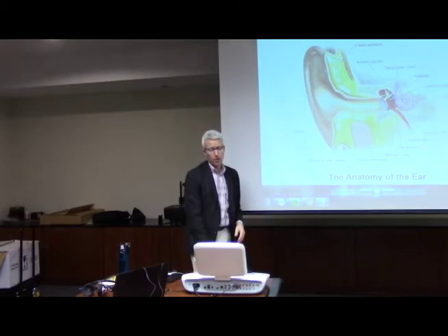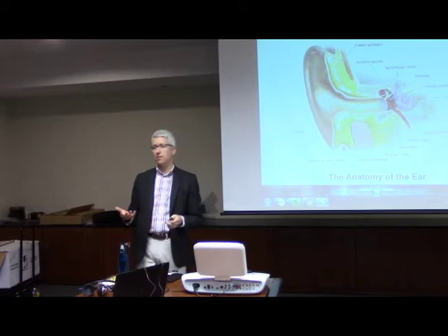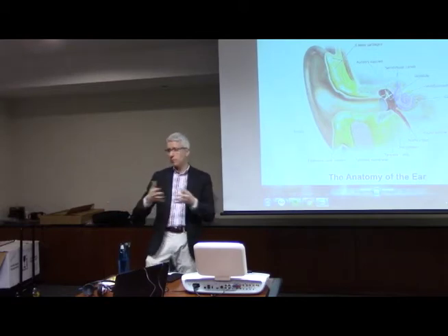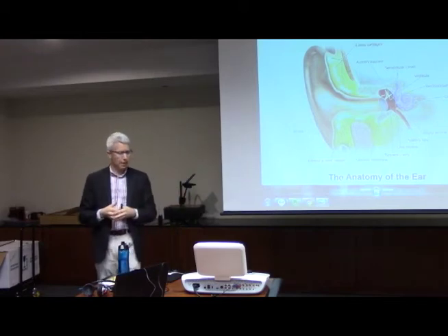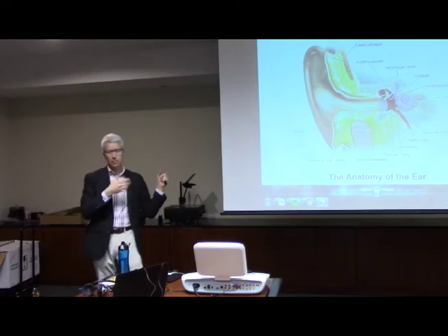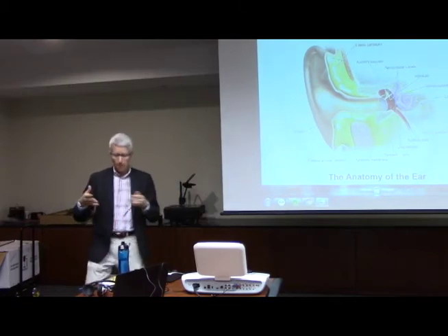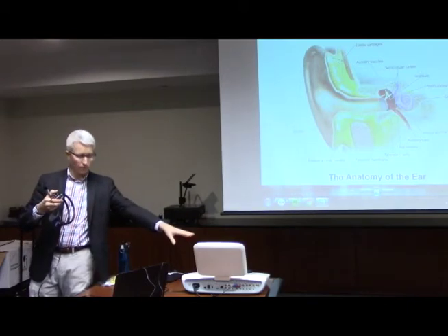The AudioStar, depending on what features you have, costs anywhere from like $9,500 up to $16,000, I guess, if you go all the way with fully loaded everything on it with the AM tests and the automated testing, that kind of thing. And then usually with this, we also have installation because in a sound booth we have speakers. I've got something I'll show you about that here in a second. And so if there are speakers, I mentioned that we calibrate these to the pieces of equipment.